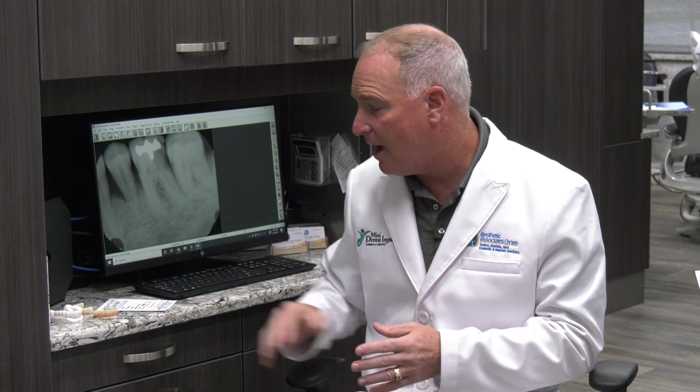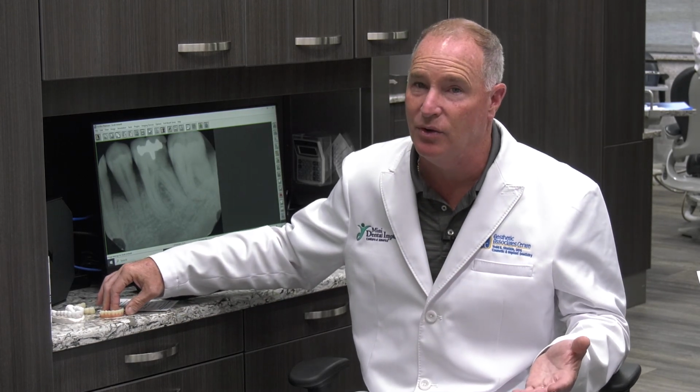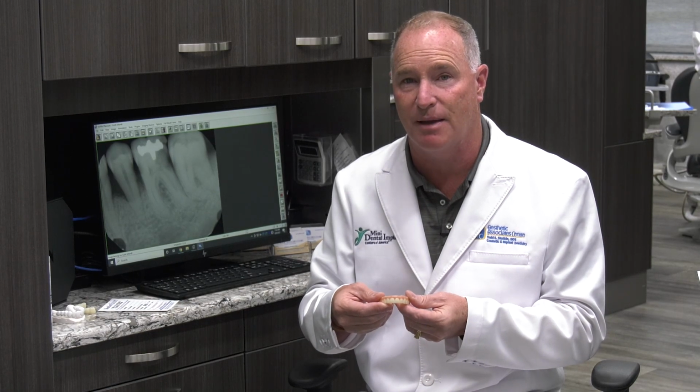You can grind them, you can adjust the bite. If you adjust the bite significantly, take a new confirmation bite with that try-in in place, and that's not a bad idea to do anyways. Okay, but go ahead and make those changes and make a note of what you changed. After you get it all finished, the next step is, if you want, you can go to a temporary restoration or a permanent restoration at that point.